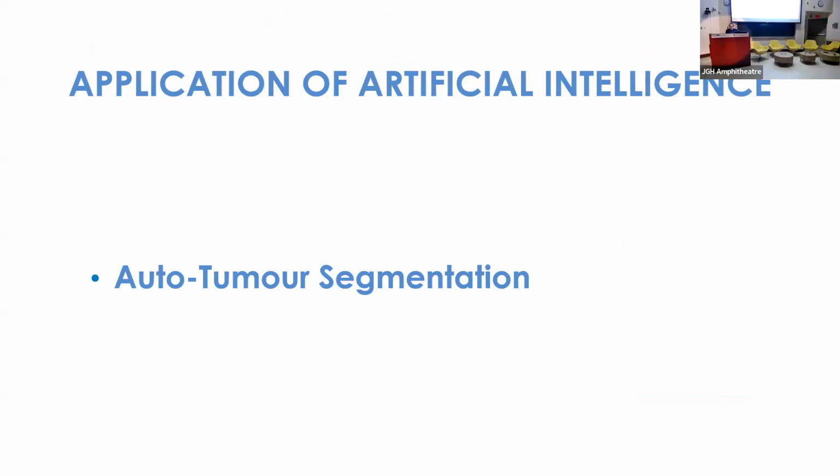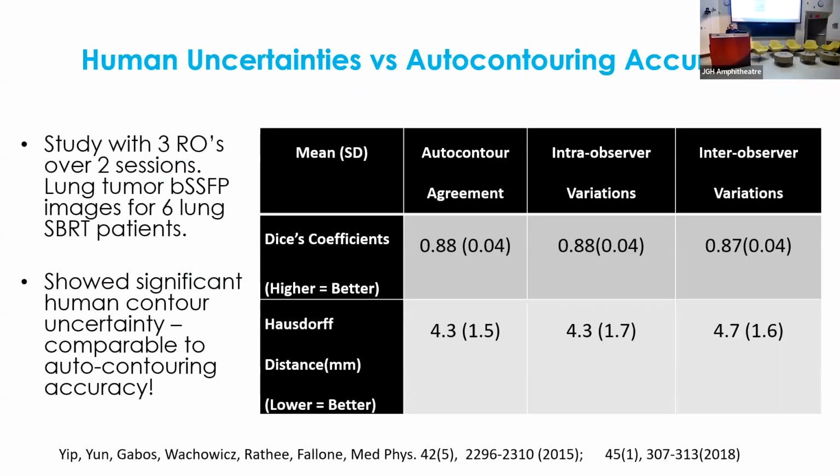Auto segmentation now. We won't go too much into this. All I want to say is we have shown that the error in our auto contouring is comparable to intra- and inter-observer errors, which is just as good as the physician doing the contouring.